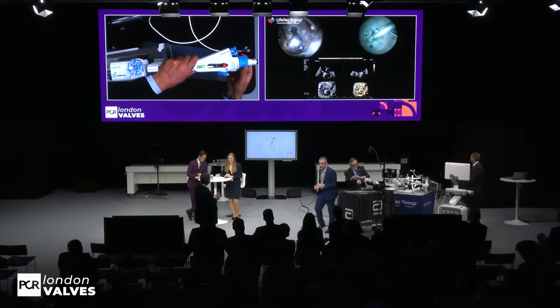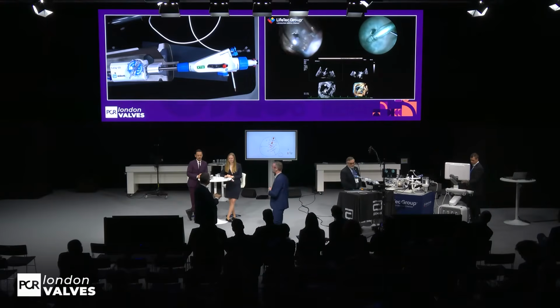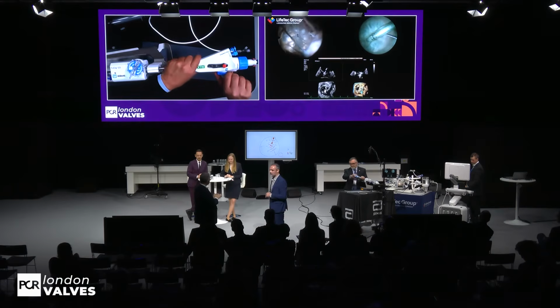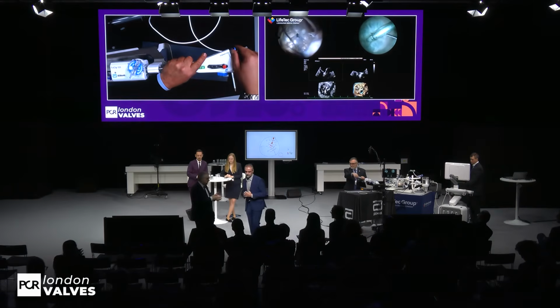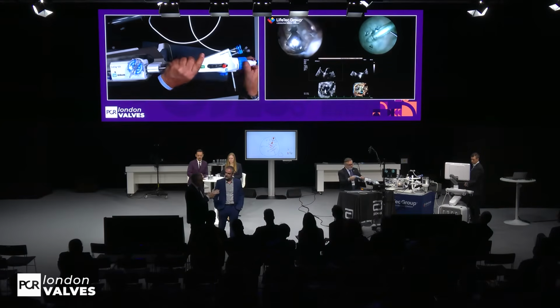Okay, so we did what you wanted. We clipped the anterior and the septal. And I don't know what would happen to this patient if the TR persists. So now you would do the clover thing, no? Yeah, the point is that you start there, and then obviously you can put the second one to jail the pacemaker lead, but always start anteroseptal first, otherwise you get in trouble for the next.